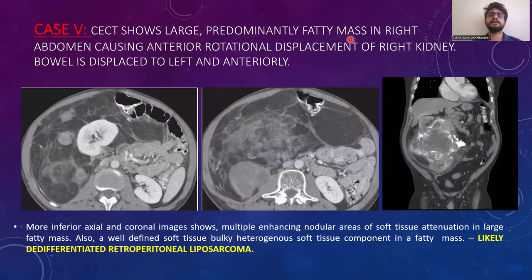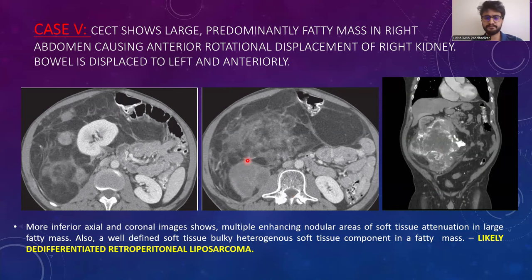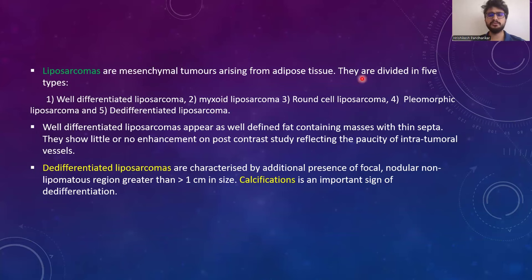Case 5: CCT shows a large predominantly fatty mass in the right abdomen causing anterior displacement of the right kidney, with bowel displaced to the left and anteriorly. Inferior axial and coronal images show multiple enhancing nodular areas of soft tissue attenuation within the large fatty mass, along with a well-defined bulky heterogeneous soft tissue component — likely dedifferentiated retroperitoneal liposarcoma. Liposarcomas are mesenchymal tumors arising from adipose tissue, divided into five types: well-differentiated, myxoid, round cell, pleomorphic, and dedifferentiated. Well-differentiated liposarcomas appear as fat-containing masses with thin septa and little enhancement. Dedifferentiated liposarcomas are characterized by focal nodular non-lipomatous regions greater than one centimeter, and calcification is an important sign of dedifferentiation.